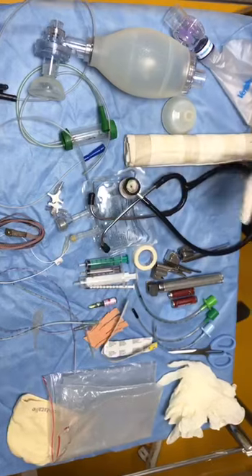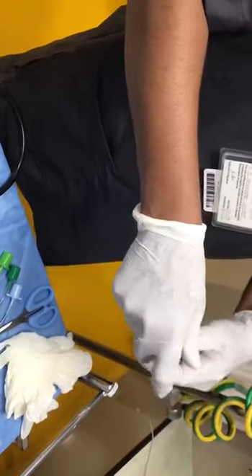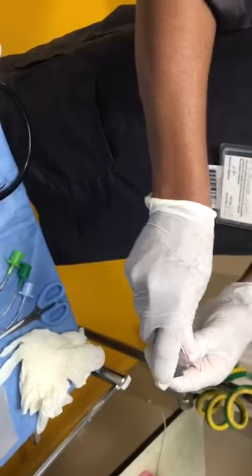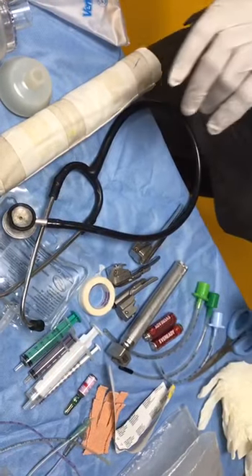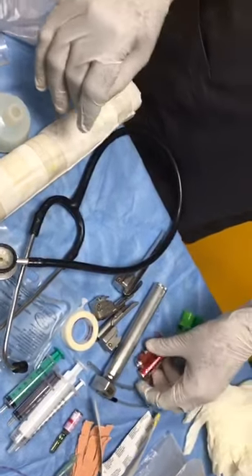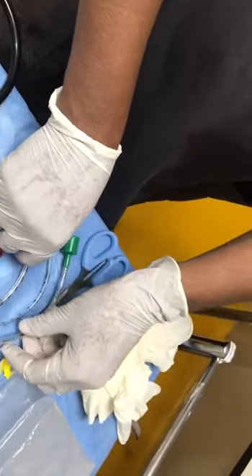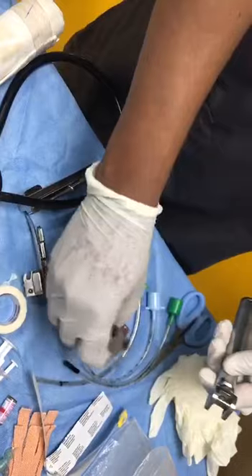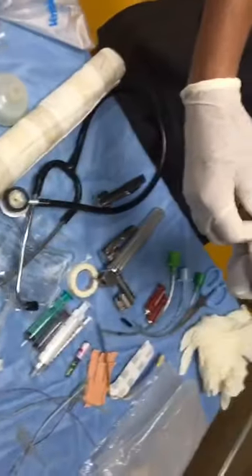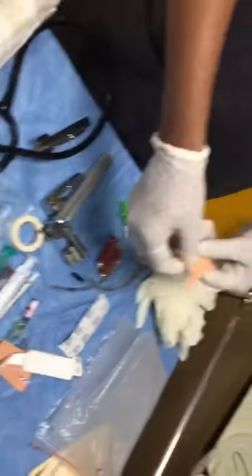And coming to the intubation part. So the laryngoscope is working. I'm going to use a zero blade. It is working, and there is an extra pair of batteries here. And we have 2.5, 3.5 size ETs, I'll use them. This is going to be 0 and double 0, I may use probably 0. And there is an tape to measure the nasotragal length, for fixing the ET tubes. There are plasters too, we have already the plasters to fix the ETs.